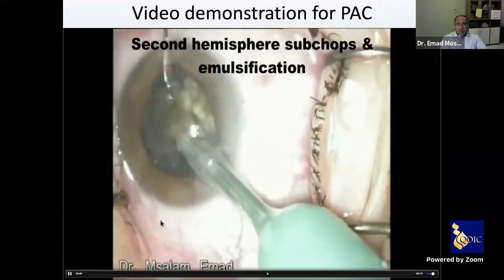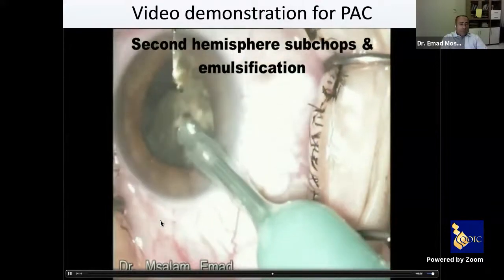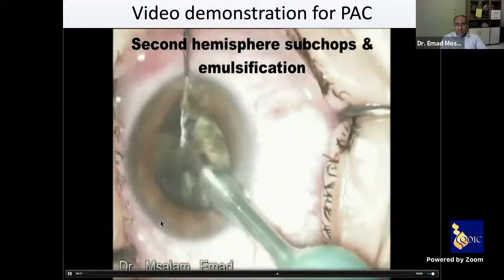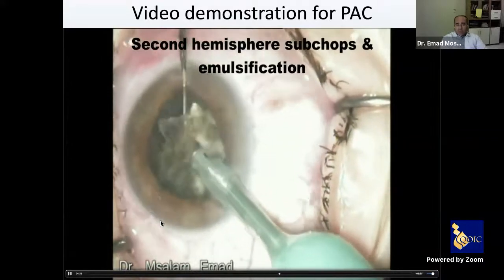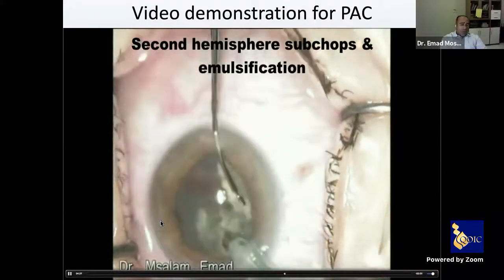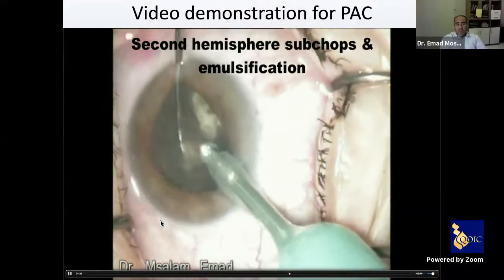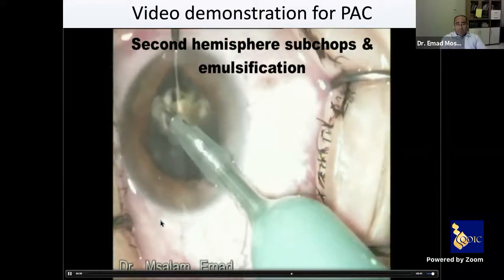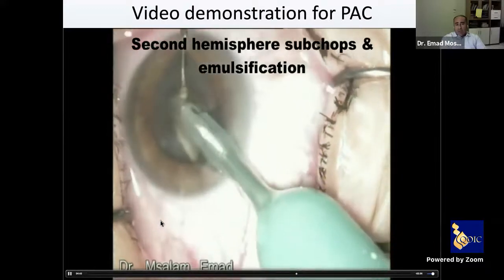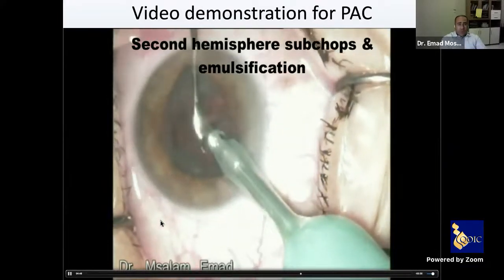As you see, the spatula is all the time between the phaco tip and the posterior capsule, avoiding any rupture to the posterior capsule. Because during our work we have fluctuation of the posterior capsule, and this spatula is not sharp, it doesn't have any sharp end to damage the posterior capsule. And the curve is the same curve as the posterior capsule. When we have any fluctuation, it hits the flat surface of the spatula, and it's a very safe spatula to work with during phaco emulsification.